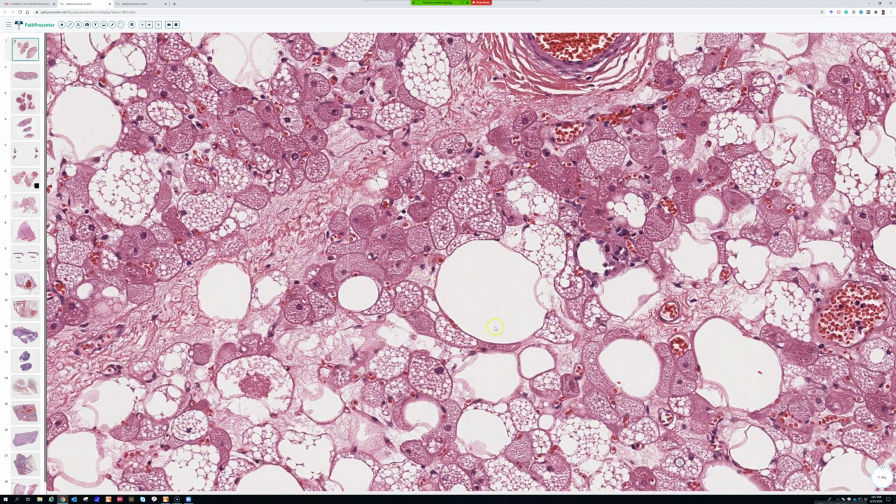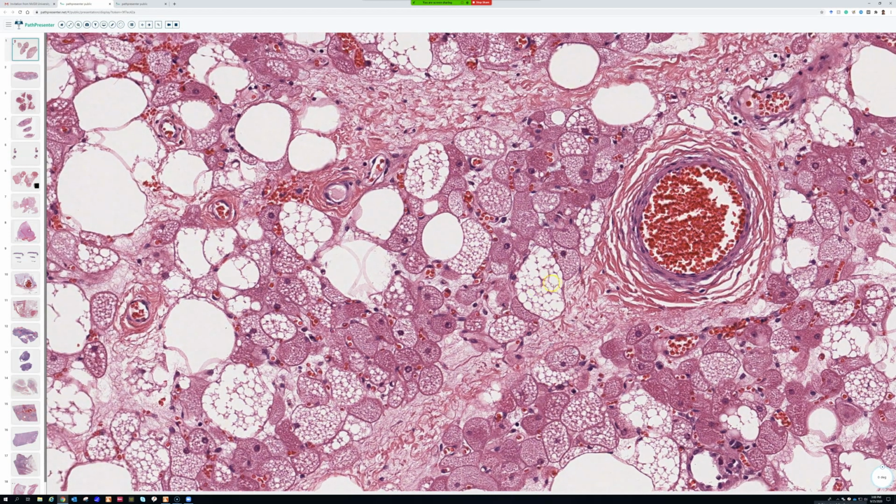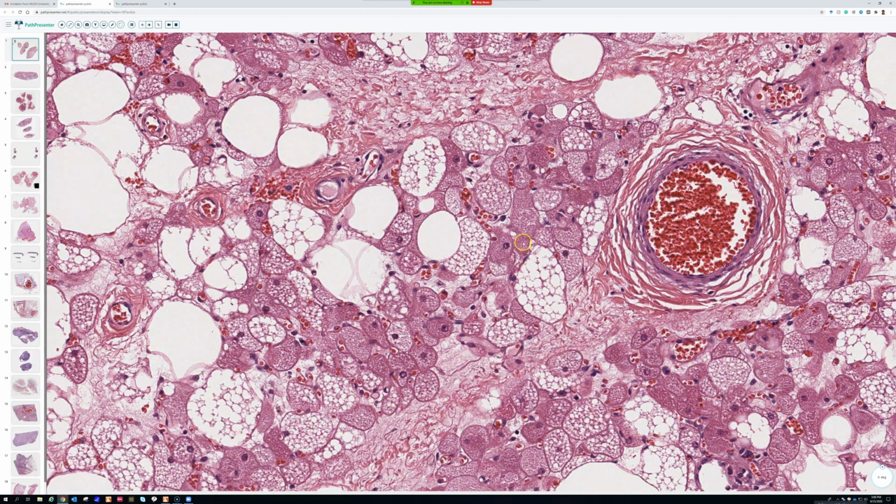Number 1 is regular mature white fat, adult fat, okay? Mature adipocytes in here, sometimes of varying size. Number 2 is these multivacuolated bubbly cells that look a lot like lipoblasts, right? They have lipid bubbles in them, but unlike, say, a pleomorphic lipoblast, they don't have big ugly nuclei. They have uniform round nuclei, which I think we can see here.